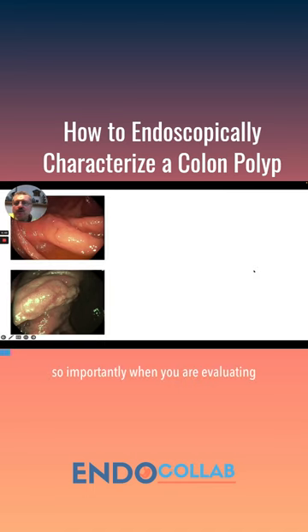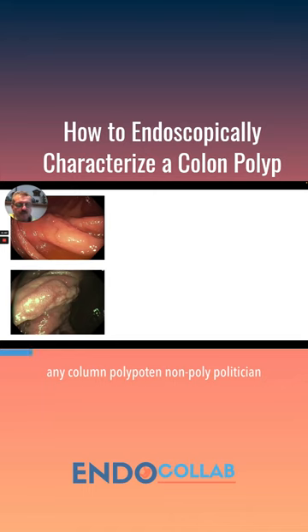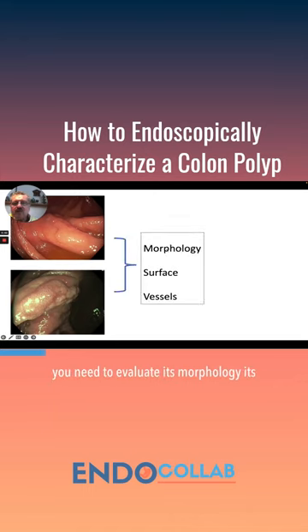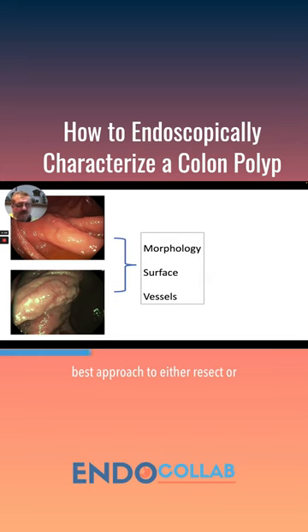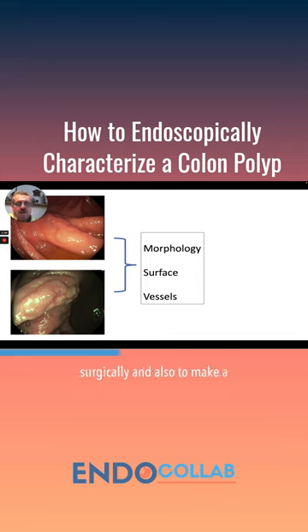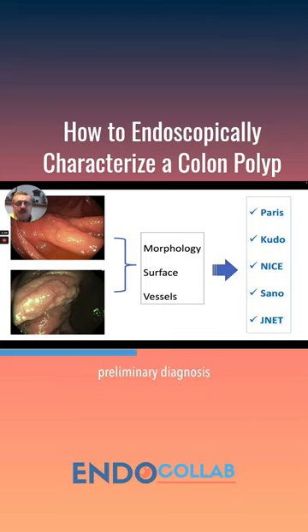So importantly, when you are evaluating any colon polypoid and non-polypoid lesion, you need to evaluate its morphology, its surface, and its vessels to determine the best approach — to either resect endoscopically or resect surgically — and also to make a preliminary diagnosis.